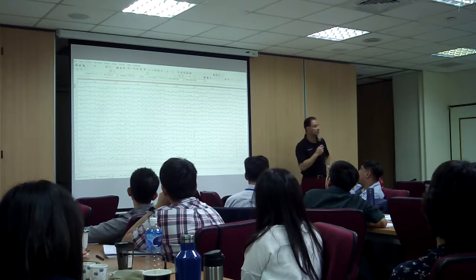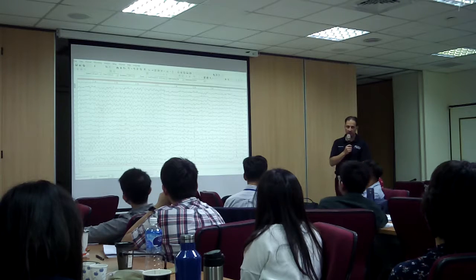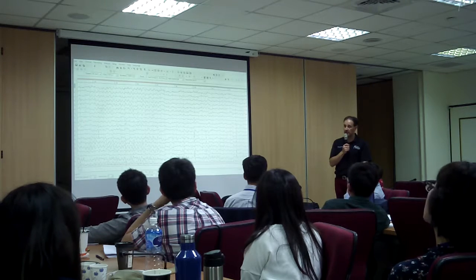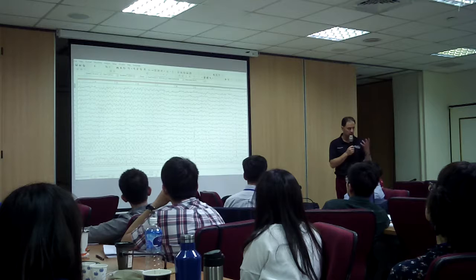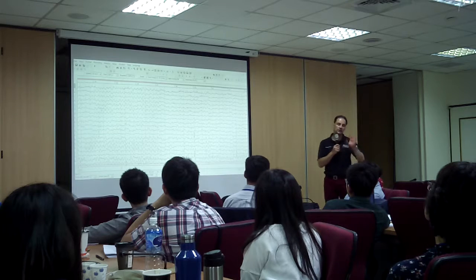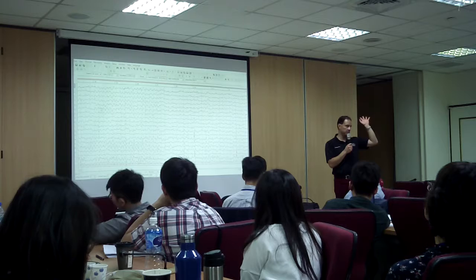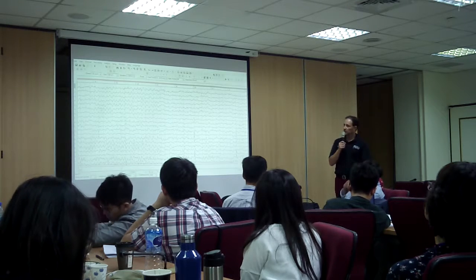So what are the clinical implications for this young man? First of all, what is that? What is the hypercoherence? What does it represent? The brain going what? Brain's going offline. So he's getting distracted. His brain is shutting down periodically, and he's just being absent, right?